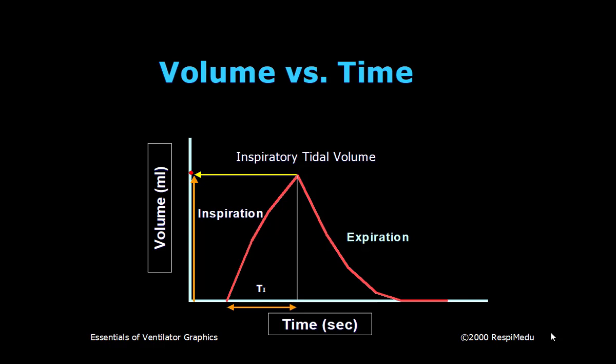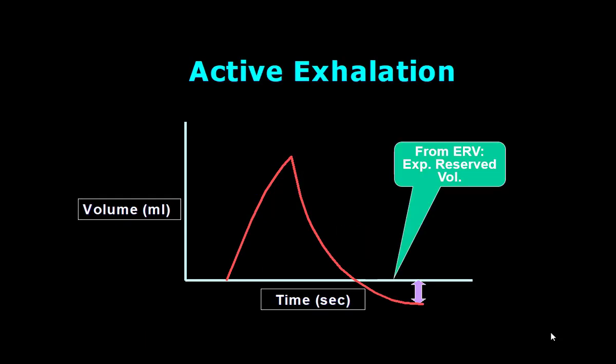Third curve, volume versus time. This is of volume control or pressure control? Volume control has a very sharp rise. Pressure control has a more curved kind of rise. So volume control. What goes in should come out. You understand that much? Nothing should be left inside. So what goes in and more comes out. Obviously, you are exhaling from your reserve volume, so that's why more will come out, and that's why there will be a fall from below the baseline. That means more volume is being exhaled out as compared to what has actually gone inside.